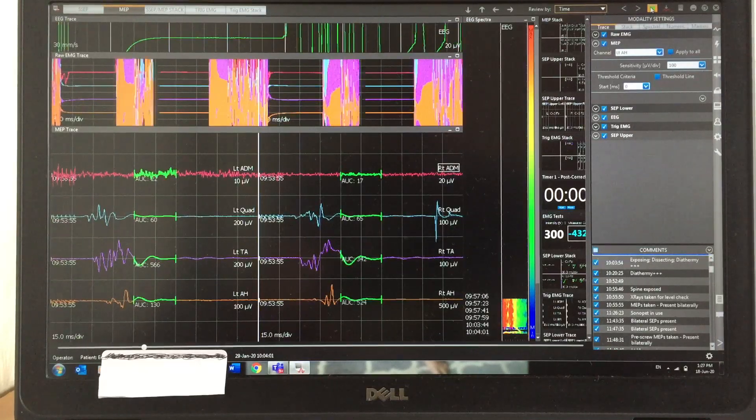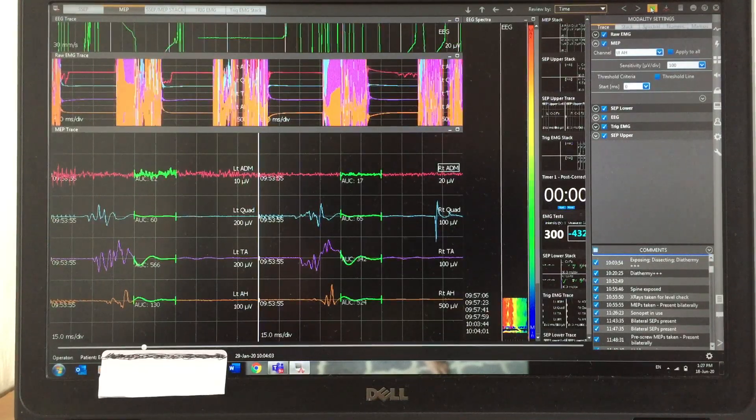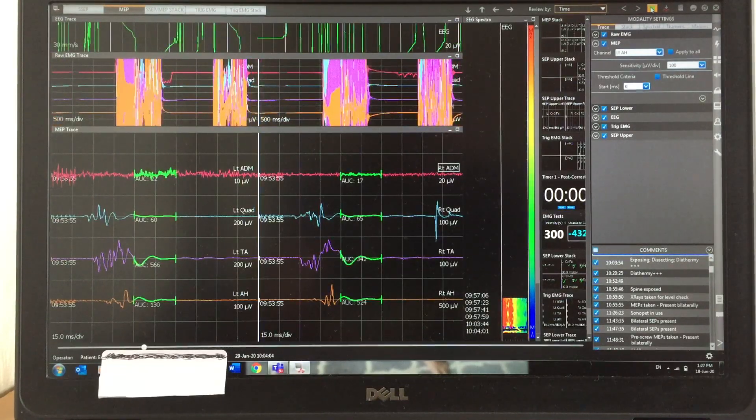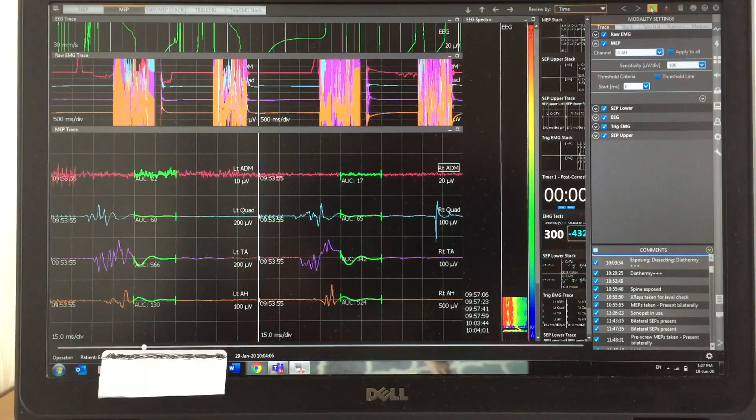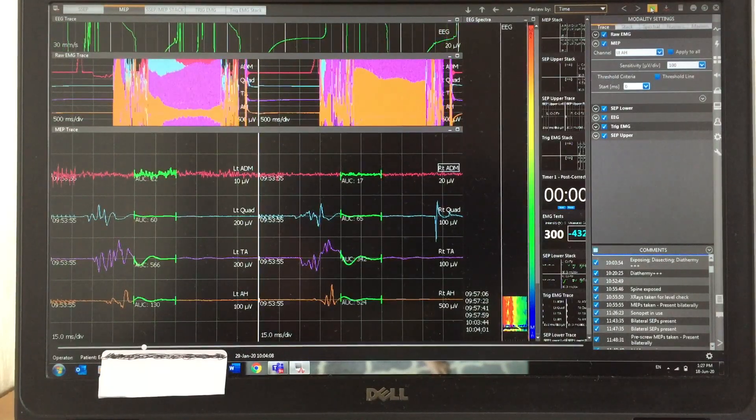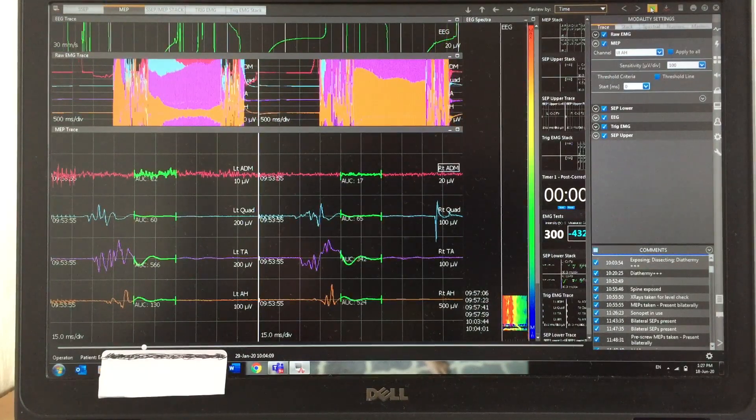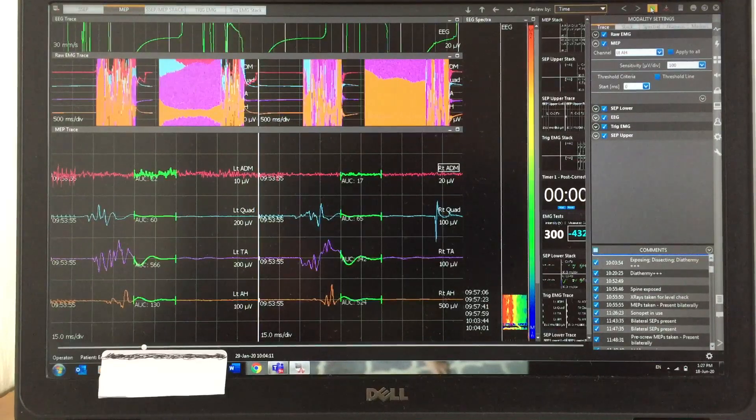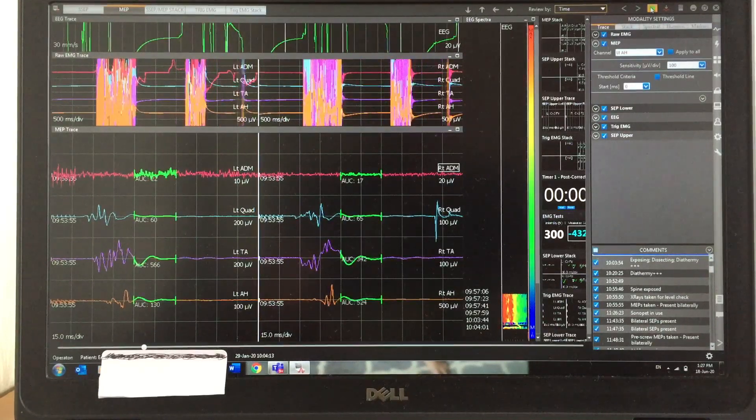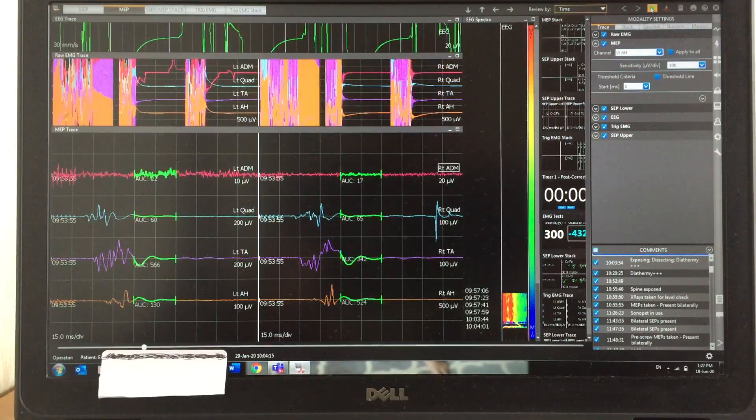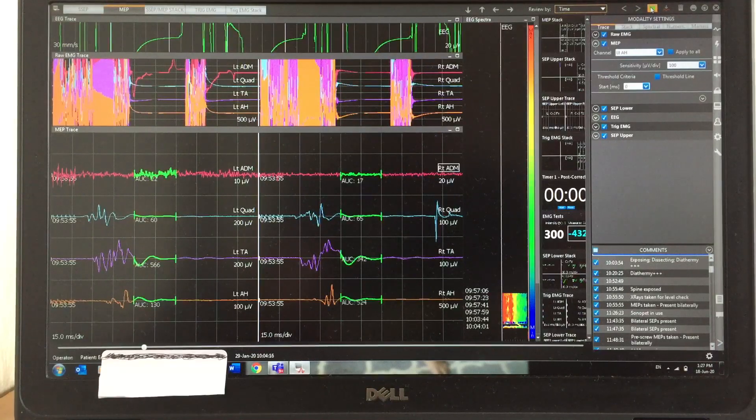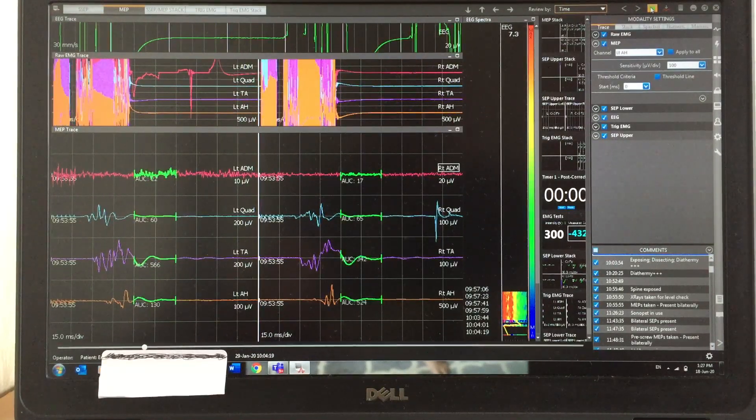Whenever they use the diathermy, all the EMG channels will fire. That's why you can see it even affects the EEG channel. You can't see any clear EEG and EMG channels because of the diathermy artifact.